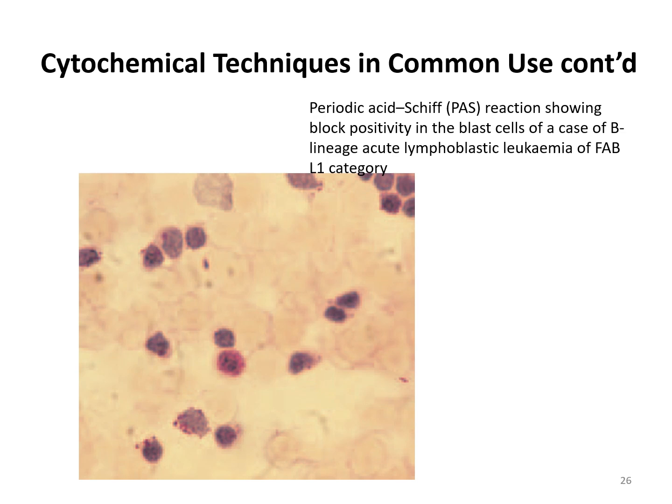Let us look at this blood film. We can see the pinkish appearance, showing the positive result in the blast cells. This is a case of acute lymphoblastic leukemia.